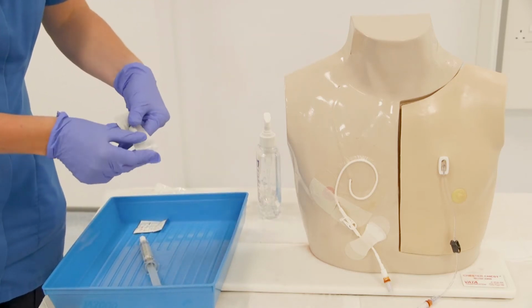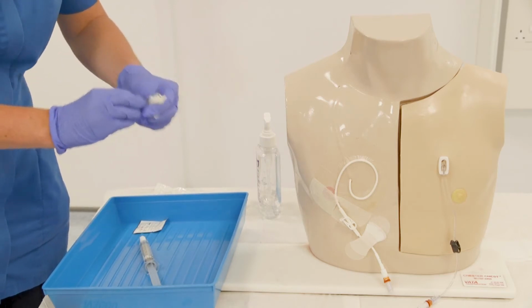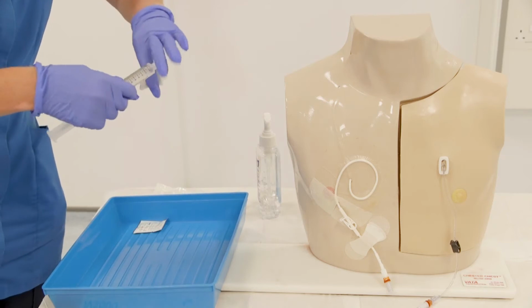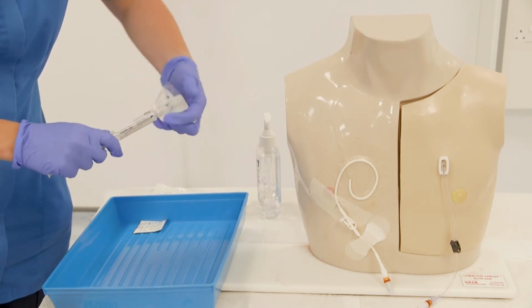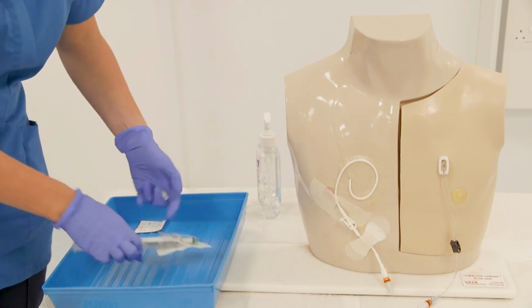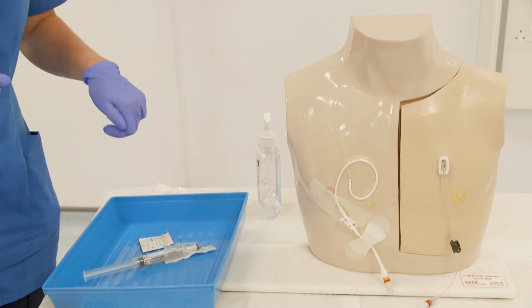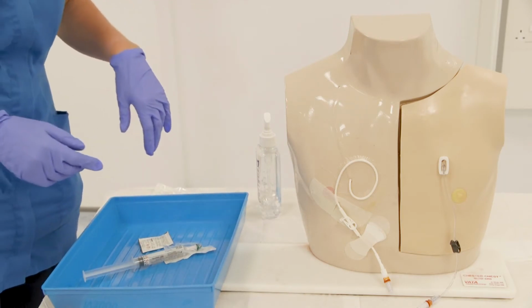So prepare the bionector or bung that you're going to use without touching the end. Get your saline that you're going to prime your line with and attach it onto the end of your bung. Once you've attached this, you can prime your bung and then pop it back in your tray, and then you can go to the patient. In between, change your gloves before going to the patient.